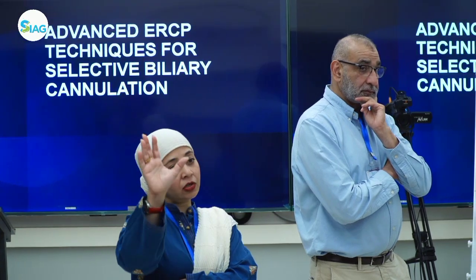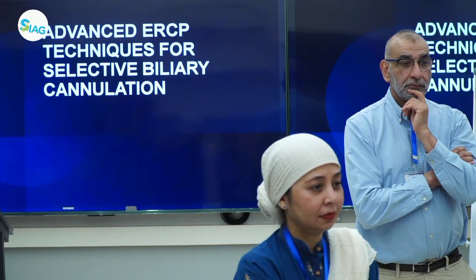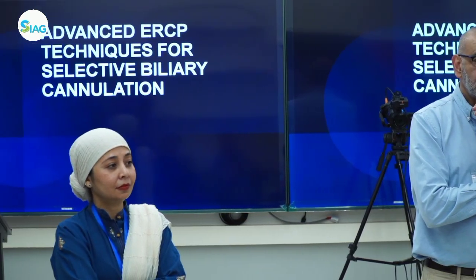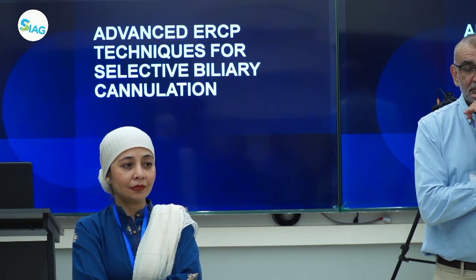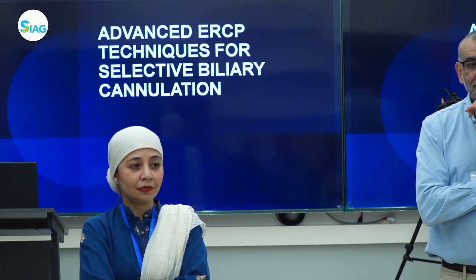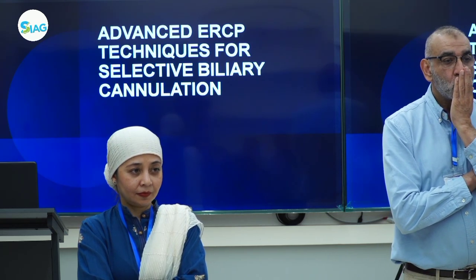So where do you want your papilla to be when you're looking at the endoscopy? इसमें मेन चीज ये होती है कि पोजीशन करने के बाद हमें पेपिला को एक एग्जैक्ट पोजीशन पे रखना होगा. What is that exact position? लेफ्ट अपर वॉल पे हमने 11 o'clock के साइड पे, the left upper wall. और हमारी जो कैनुलेशन होगी वो 3 o'clock से होगी. और उसके बाद हमें पेपिला की स्टडी करनी होगी कि इस टाइप का पेपिला है और इसमें ट्रैक्ट किस तरह हमें जाना है. ये दो चीज़ें.